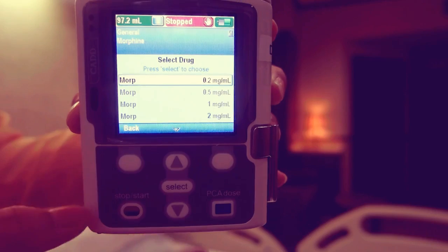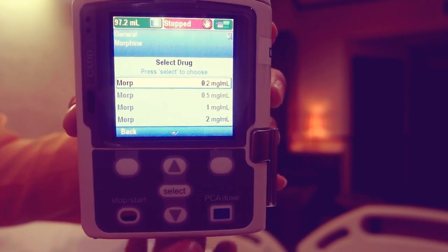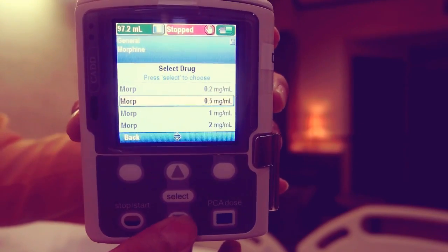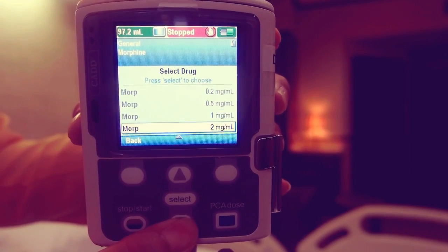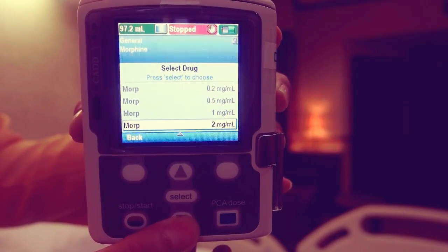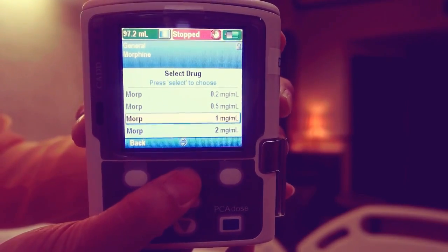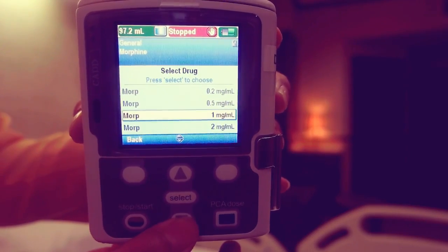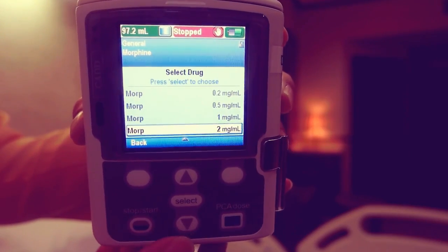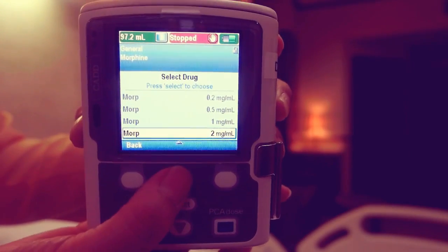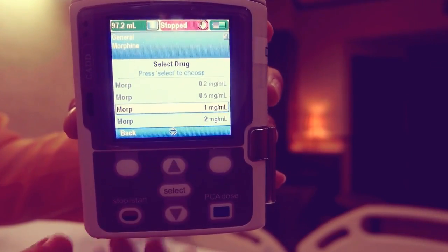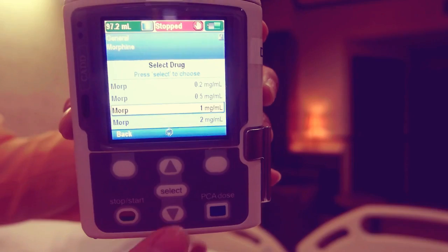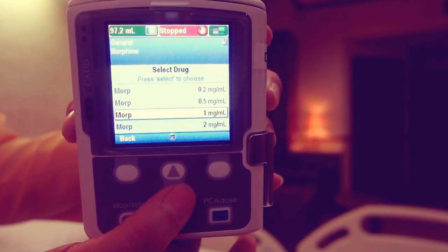Scroll up and down again to highlight the desired drug and concentration. If the desired therapy is morphine 1 mg per ml, highlight it and press select.